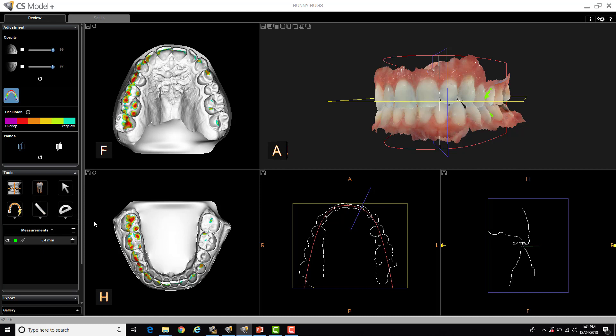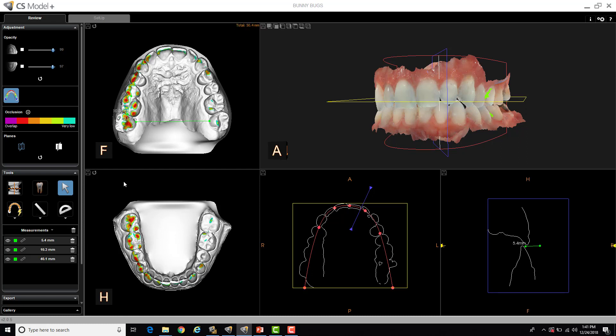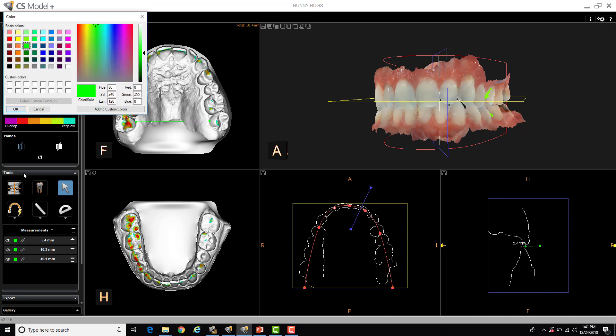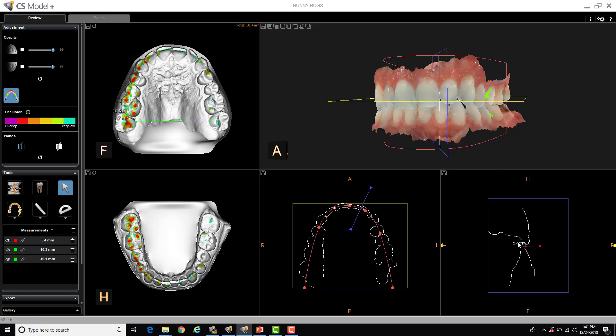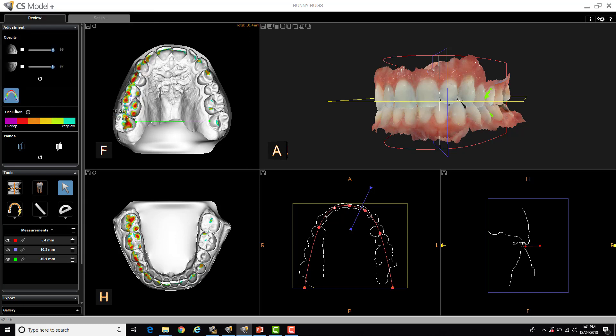I can also take measurements on my upper occlusal and lower occlusal. So if I wanted to take mesial-distal measurements, I could. I can also take cross-arch measurements as well, like so. Down in the lower left-hand portion of the screen, you can see all three measurements that I've taken. If you want to differentiate the measurements more easily, you can change the color on one of them or all of them. And you can see here, this one is now red, so I know which one is which. I can change this one to purple or whatever.